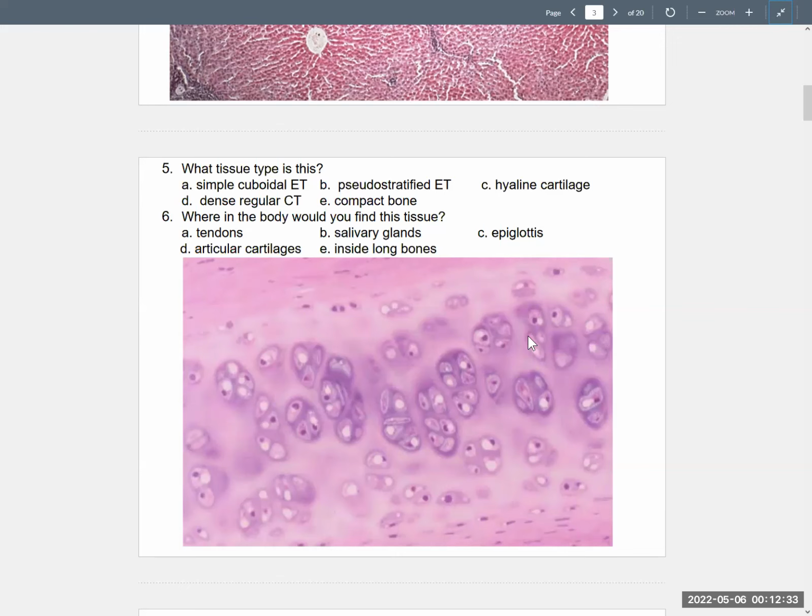Is it hyaline cartilage? Yes, it's hyaline cartilage. Now, for me, I think of boiling plastic. And you see bubbles coming up, like when you look at a pot of water and it boils. This is all the hyaline cartilage. These are chondrocytes.